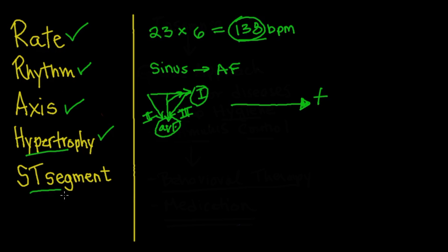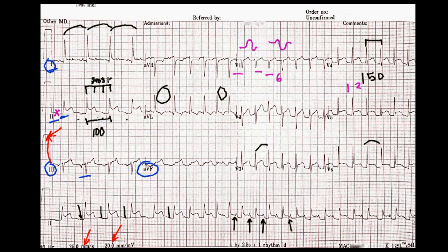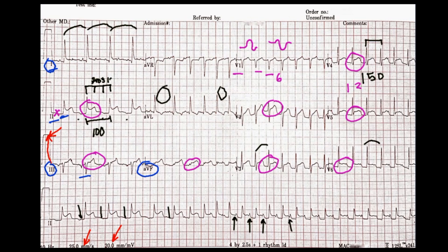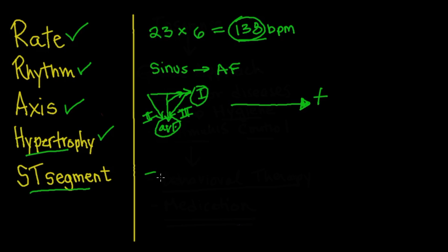The next and last thing is ST segments — and that's really where the key is. We're seeing big-time ST segment elevation in lead II, V2, V3, V4, V5, V6, lead III, and a bit in AVF. We're seeing it all over the place. It's not in any one particular distribution. When you see global ST segment elevation throughout all the leads, the one big thing you've got to think about is pericarditis.